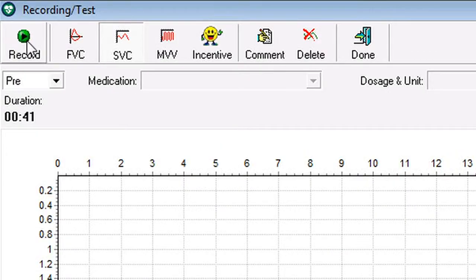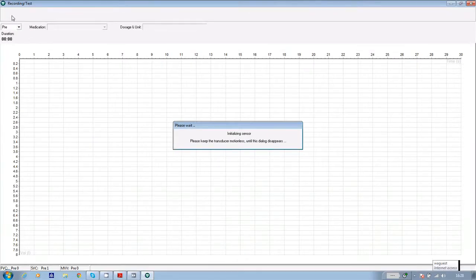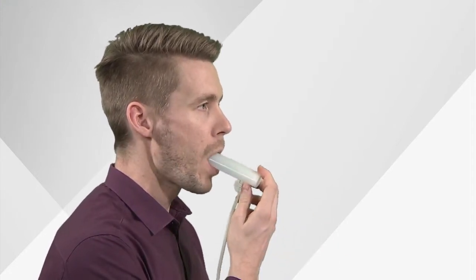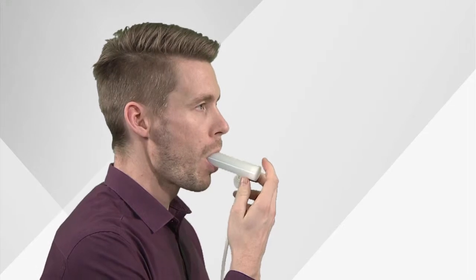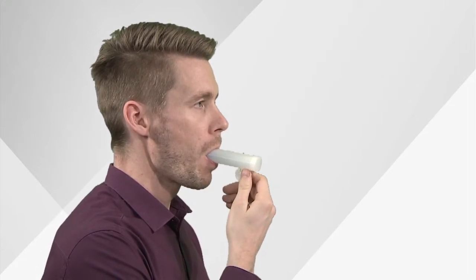Click on record in the top left hand corner of the screen and wait for the stabilizing flow sensor message to disappear. The patient should then breathe in calmly to their full lung capacity, pick the sensor up, place it in the mouth, and breathe out slowly until their full volume is achieved.